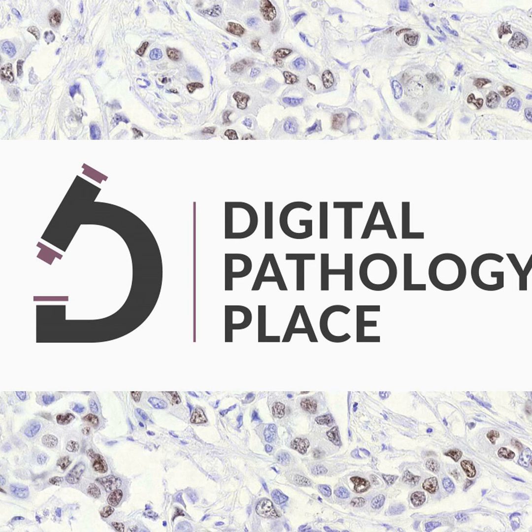This is because digital image analysis tools can be used to standardize the measurement and quantification of histological features, thereby reducing inter-observer variability. Thus, by improving accessibility, reducing logistical issues, and enhancing consistency of evaluations, digital pathology can greatly benefit the logistics of multi-site clinical trials.